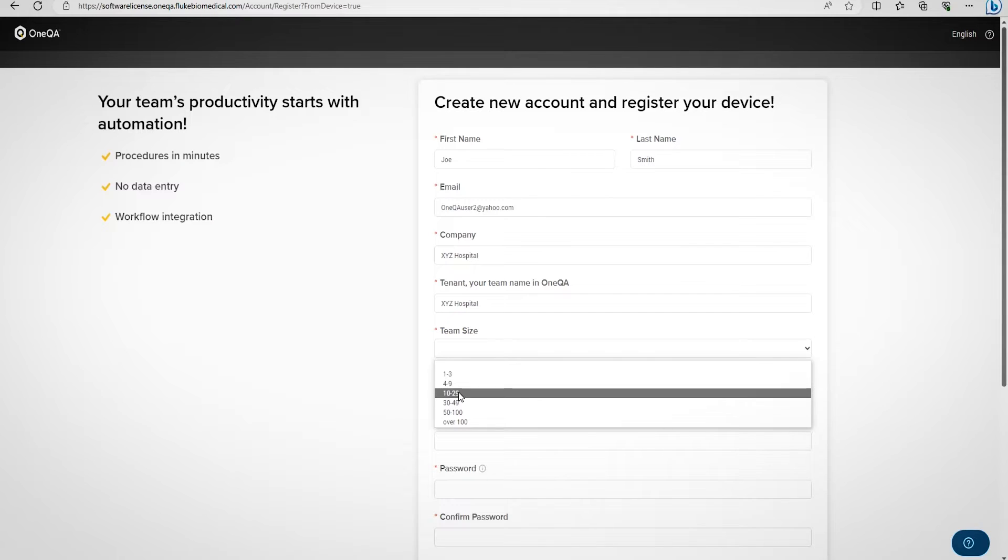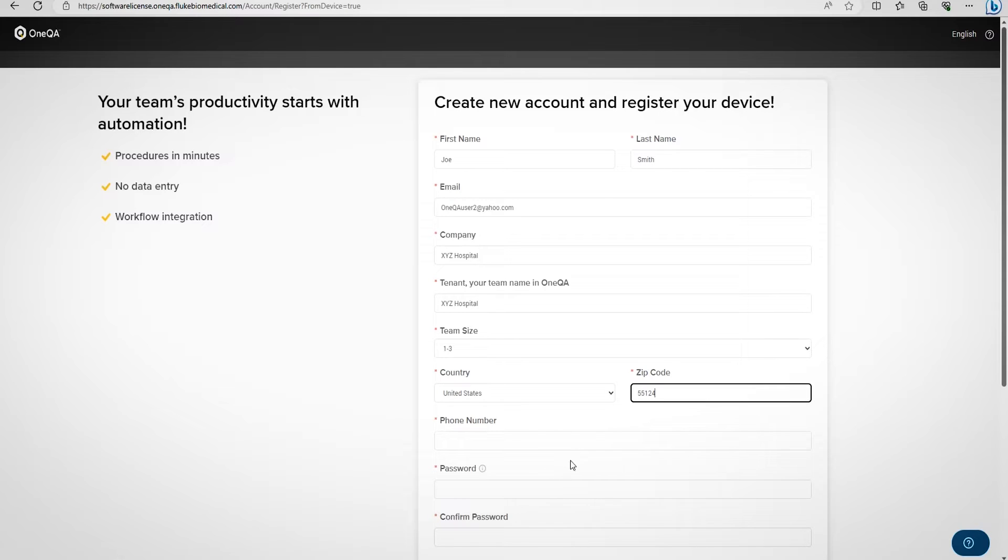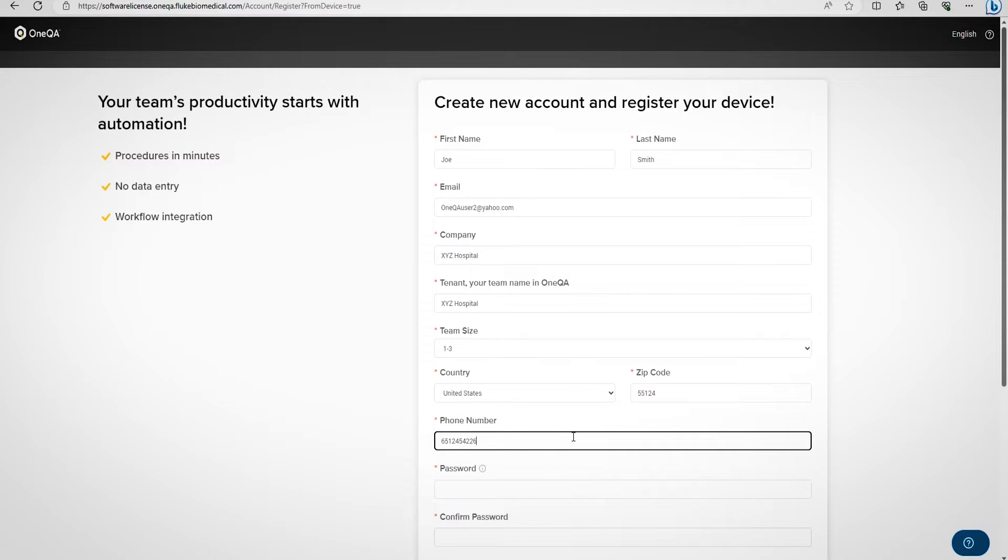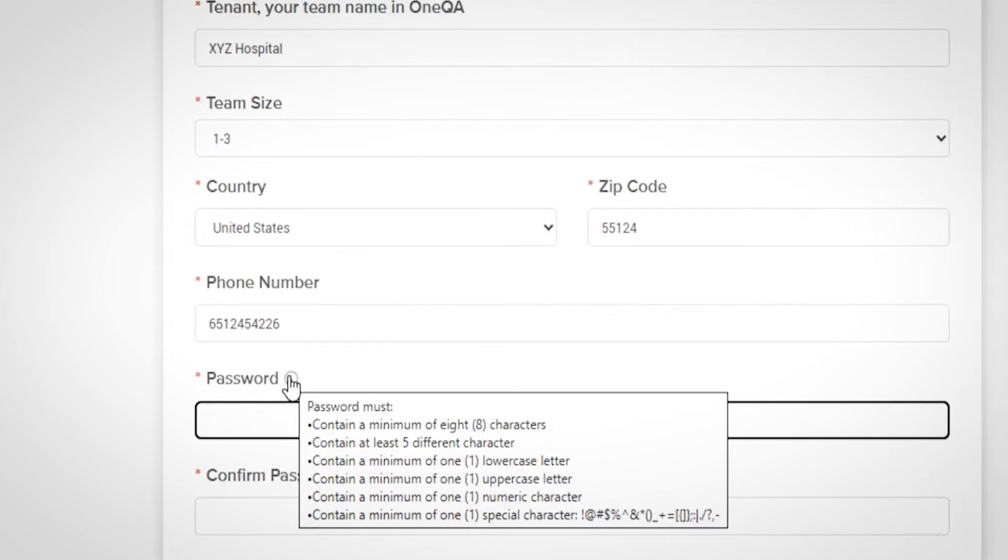Next, indicate your team size. This question is asking how many members are in your current team at your facility. Finally, set your password. There are password complexity requirements displayed on the screen.